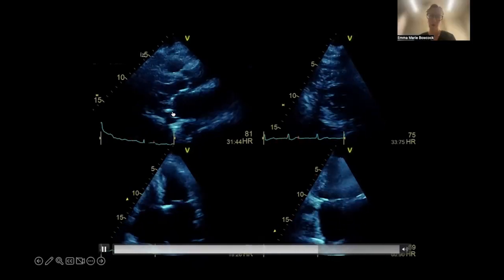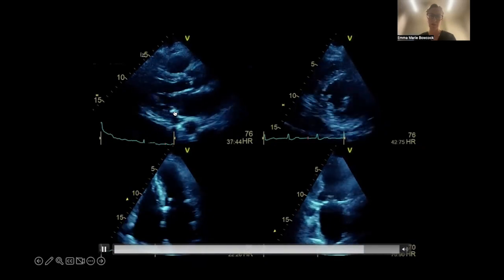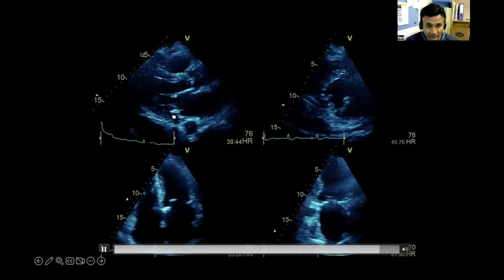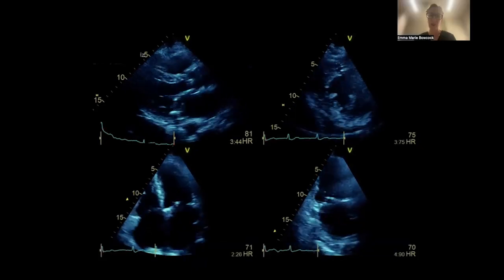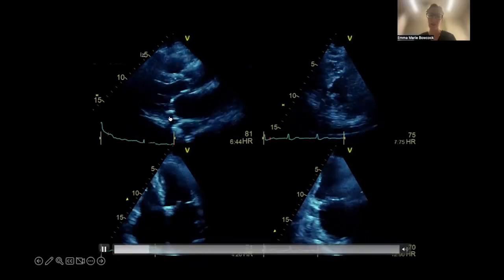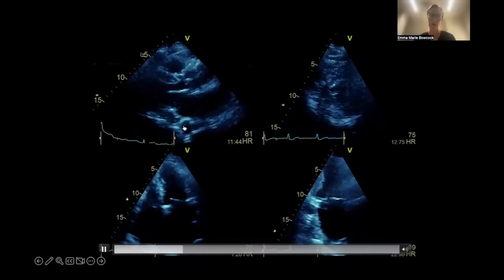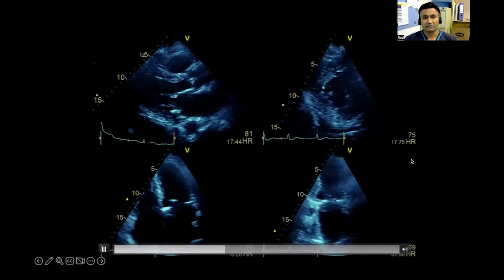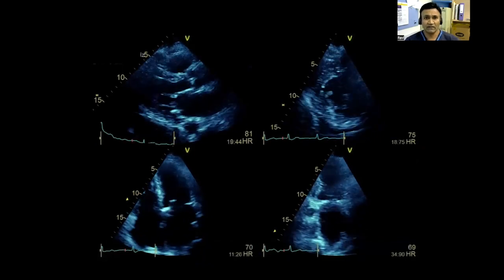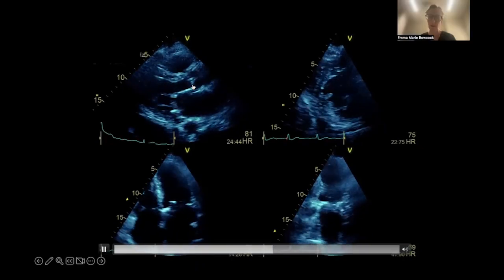Yeah. And what would you call this, Ravi, where my cursor is? That's the posterior mitral leaflet with a bit of calcification there. Yeah, so posterior mitral annular calcification or posterior MAC. And as you say, some calcification on this anterior leaflet. Yeah, nice. And so even the aortic valve cusps may not be opening that well. Yeah, they're not completely opening.